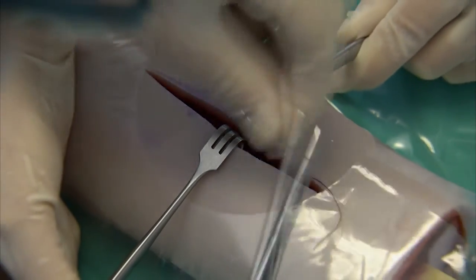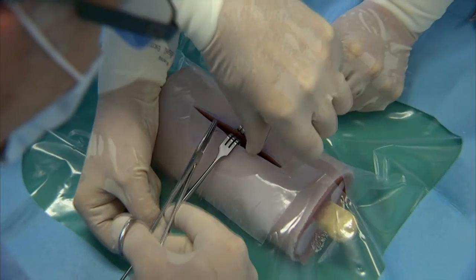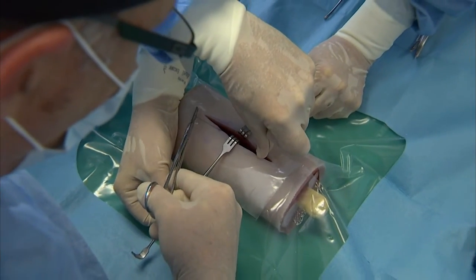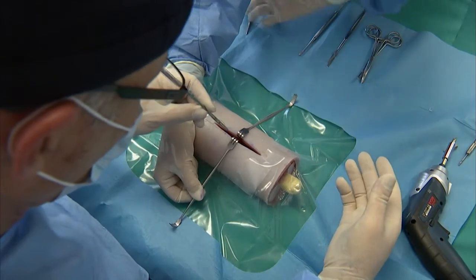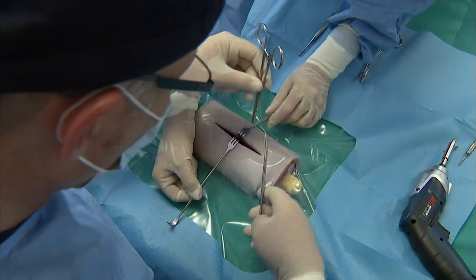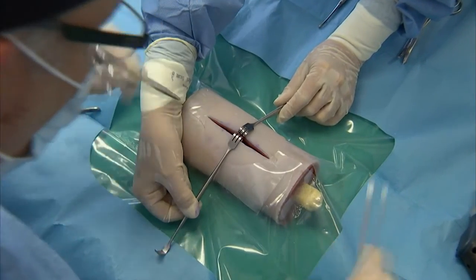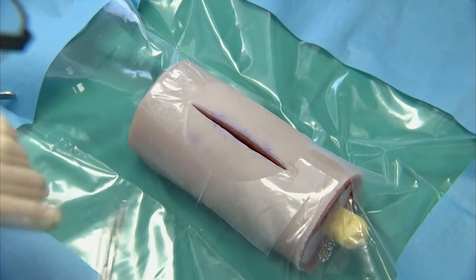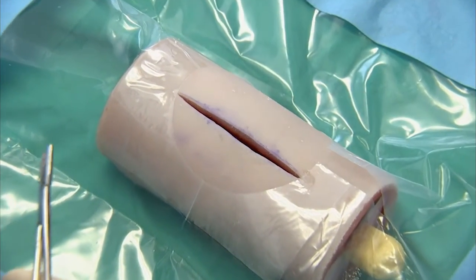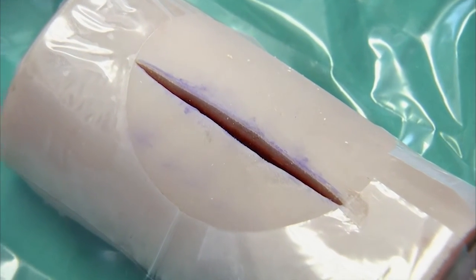When the surgeon ties the knots, the assistant first eases and then completely releases the retraction to allow the opposing wound surfaces to approximate. Once the suture knot is securely tied, the assistant cuts the ends of the suture about 1 to 2 millimeters away from the knot. If the suture is cut too close to the knot, spontaneous unraveling may occur, and if cut too long, one will leave an unnecessary amount of foreign material inside the wound.